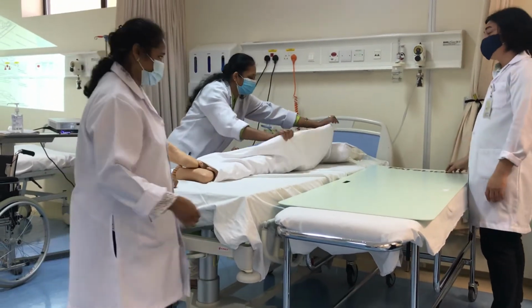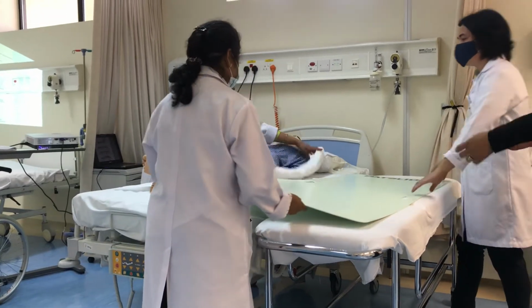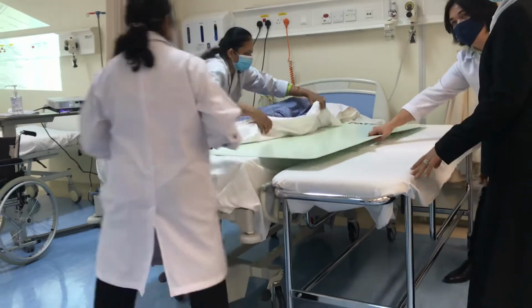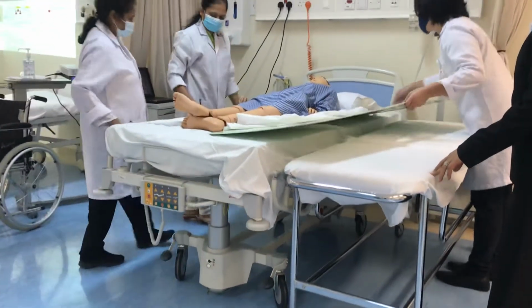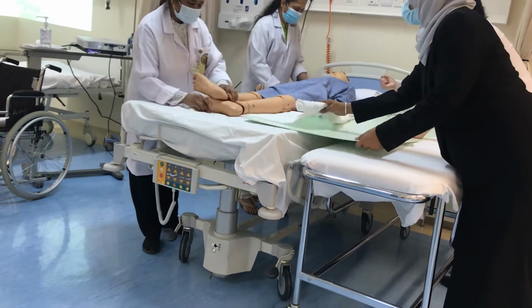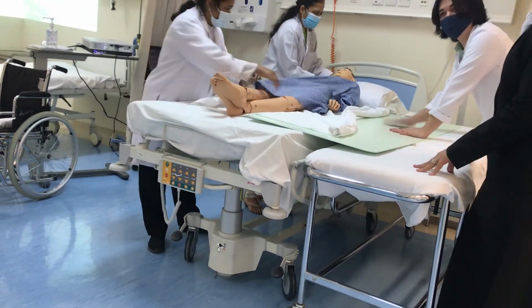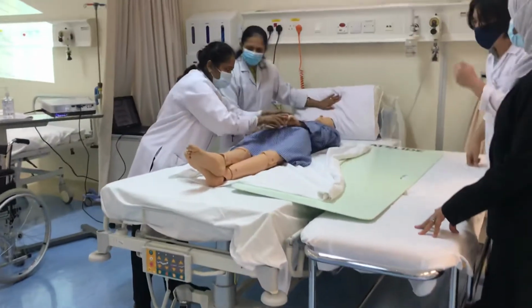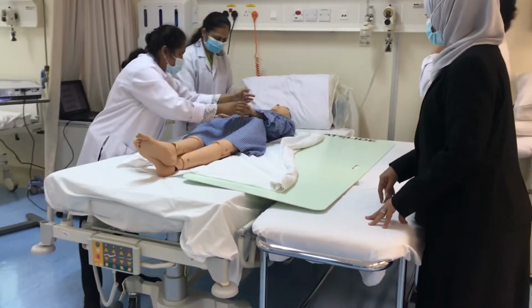You can actually insert this one under, actually the easiest one, so that you just need to pull this one. You can put this one in here so that no need to lift, you just need to slide. Or you can put this one entirely on the back and pull this one to this side. It's also fine. The head we should be careful.